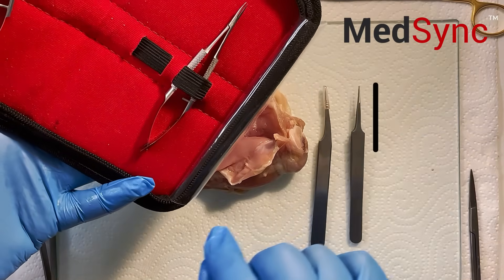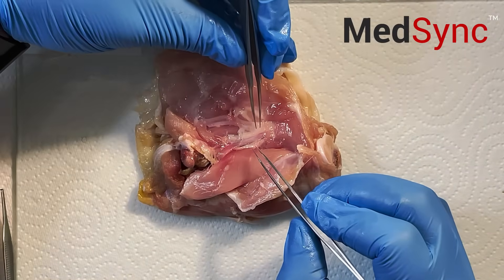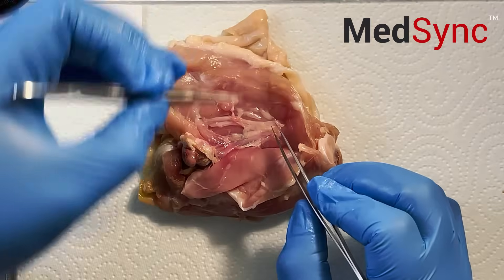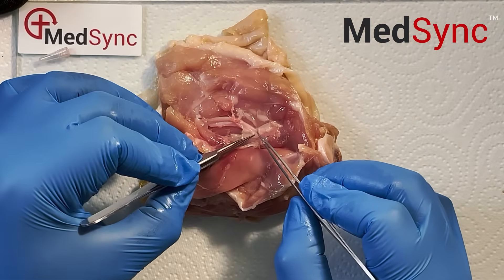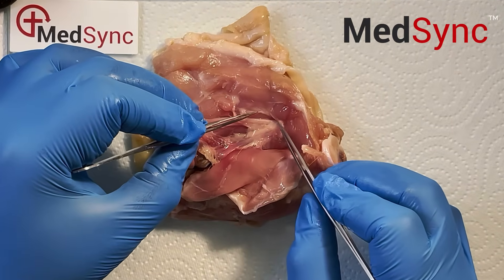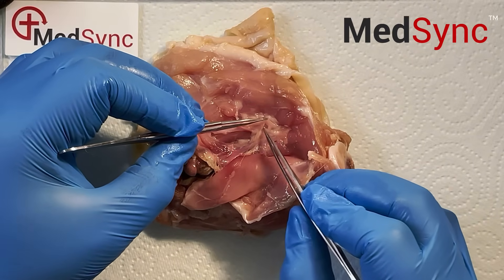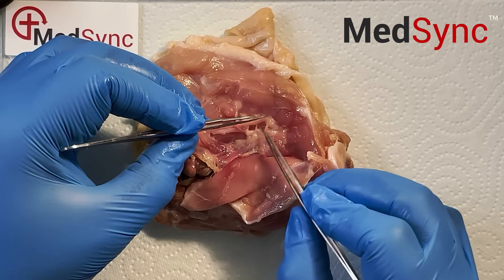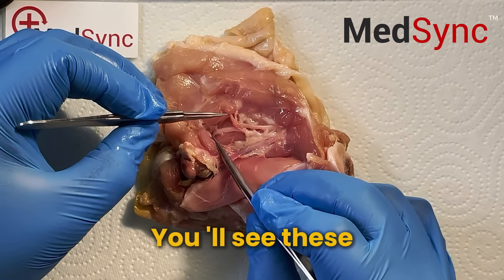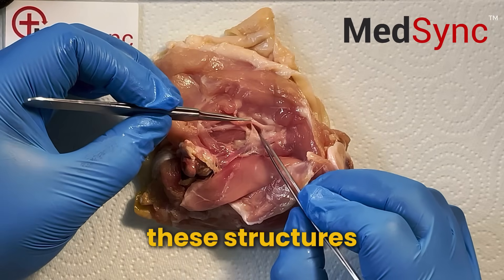We're simply going to reflect off the adventitia to free up the nerve, the artery and the vein, completely around its front surface and its back surface. As you proceed, you'll see these tiny branches of vessels connecting all these structures.